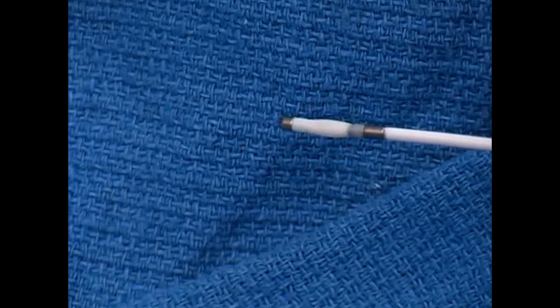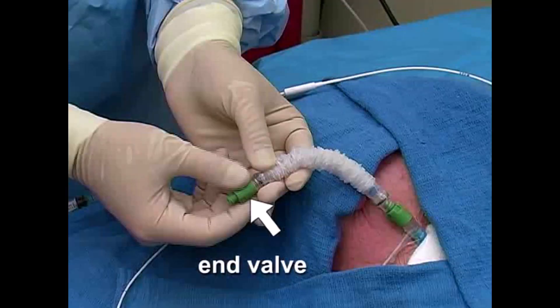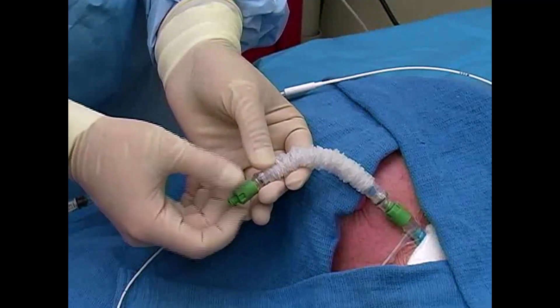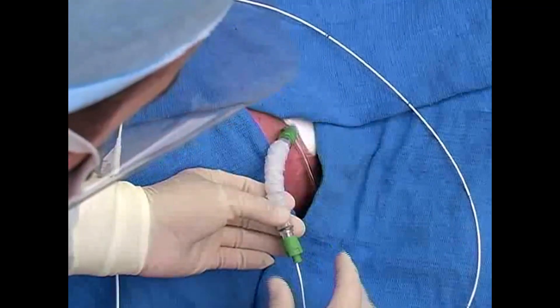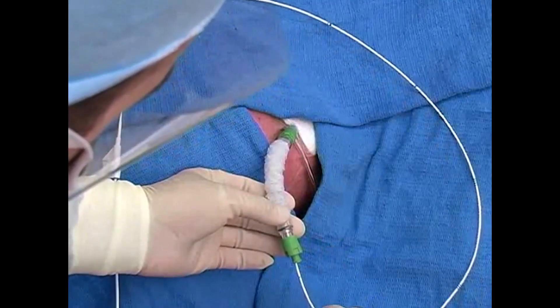Make sure that the balloon is fully deflated before proceeding. If your sterile sleeve is equipped with an end valve, open it by turning it counterclockwise. Next, gently insert the catheter through the valve and into the sterile sleeve.